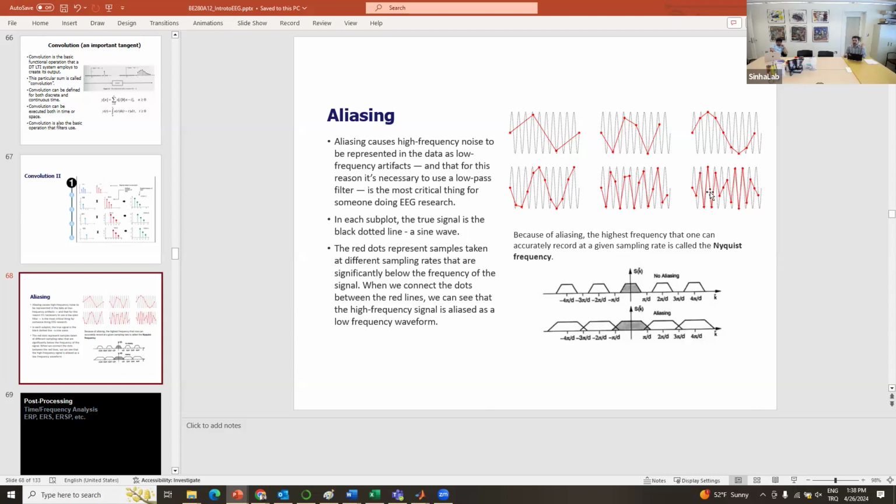But if you increase that sampling period, then you will see something like what is shown on the left, until you get here. So the question is, what must be the number of samples that I should retain to be able to reconstruct the signal again?